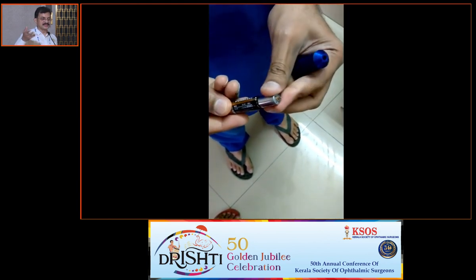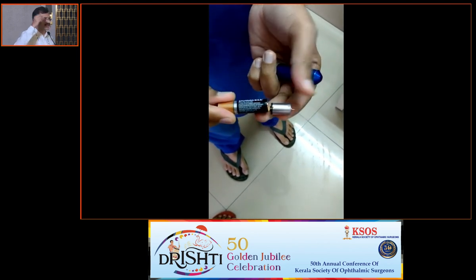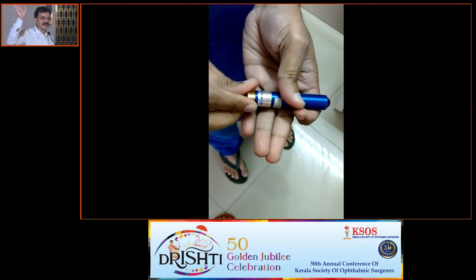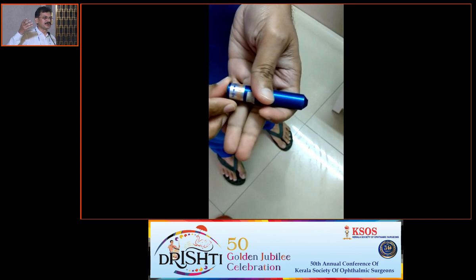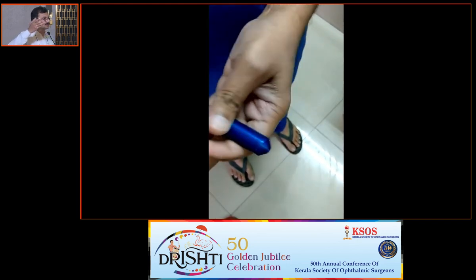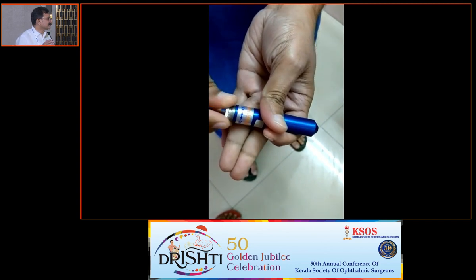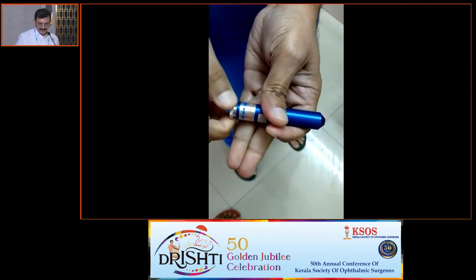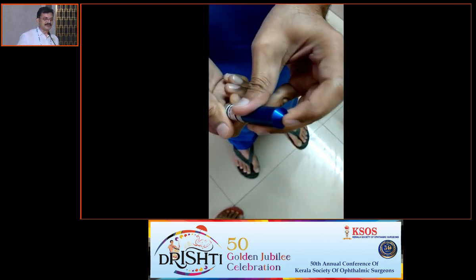You have to watch the battery because during COVID times we never visited the hospital for 1 year. They kept it like that, with the battery in. I lost 2 diamond bars. The battery leaked and the motors are all gone. I had to buy a new one. So when you are not using it for a few months, for example, you go on a long trip, remove the battery and keep it. If you leave the battery, it will drain and you will lose the unit. It's only 5,000, 6,000. It's not big money, but still it's a waste.